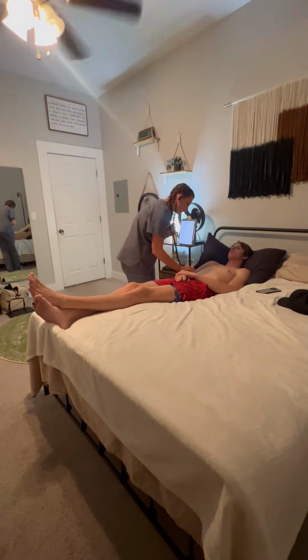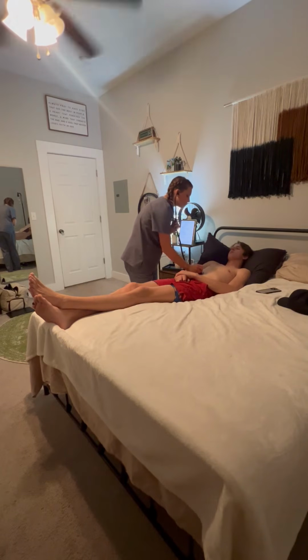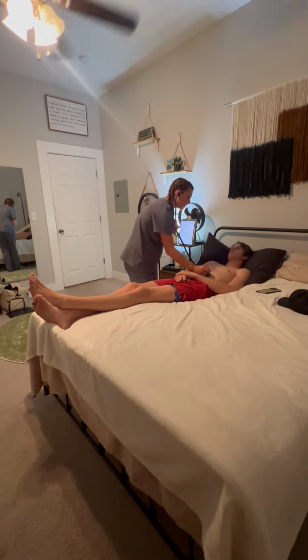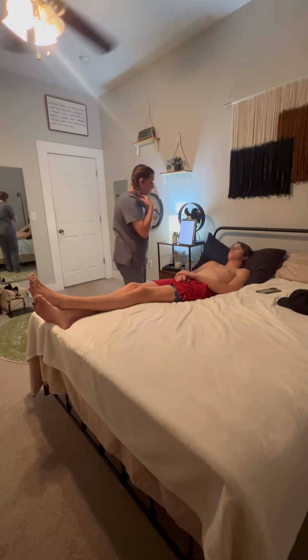We're going to start in the right lower quadrant with the diaphragm. Right upper. Left upper. And left lower. Alright, that all sounded good.